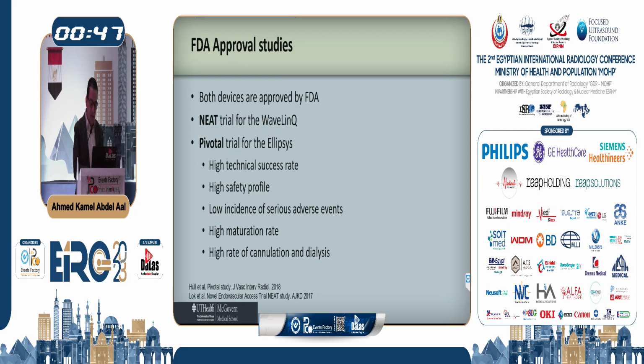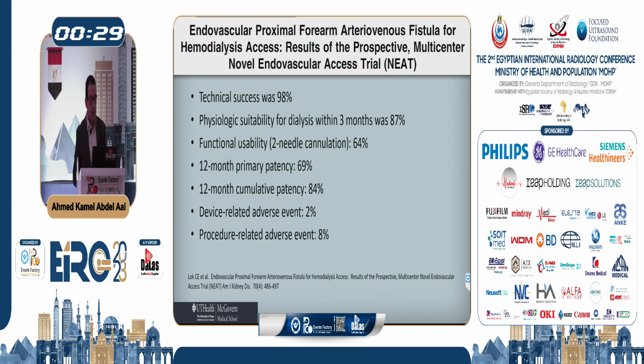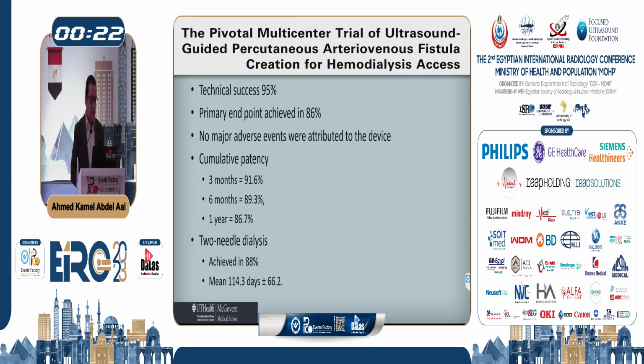Outcomes: there were 2 studies that were done to get these 2 devices approved, which are the NEAT study for the WavelinQ and the pivotal study for the Ellipsys. Both studies showed high technical success, high safety profile, low incidence of serious adverse events, high maturation rate, and a high rate of cannulation and dialysis. This is the NEAT study by Lok from Canada, again showing really high technical success, just like we mentioned, and the cumulative patency is great, running around 85 to 90%.